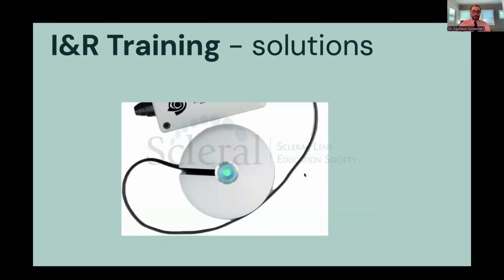Okay, so here's another stand that's available out there. This is made by a company called Seagreen. This has a stand, but it also has an illuminated light source in the middle, so it makes it, I think, easier to look at the target and keep your eyes sort of locked on a particular lightable device. So this one comes at a price point. I want to say this is several hundred dollars, but I have a few patients that use this and really like it. So this is something that's available out there.